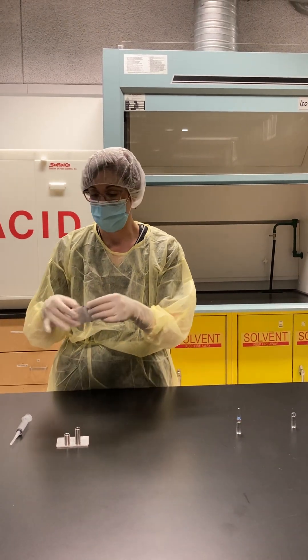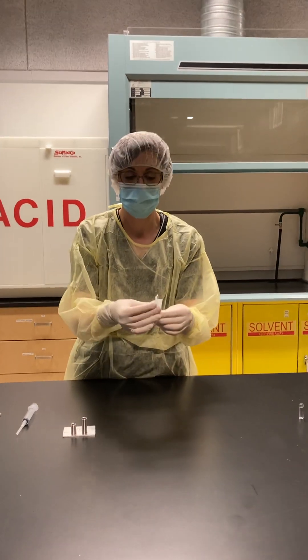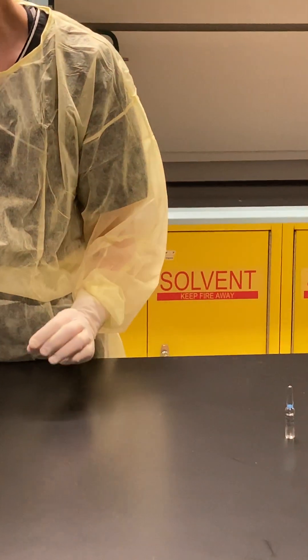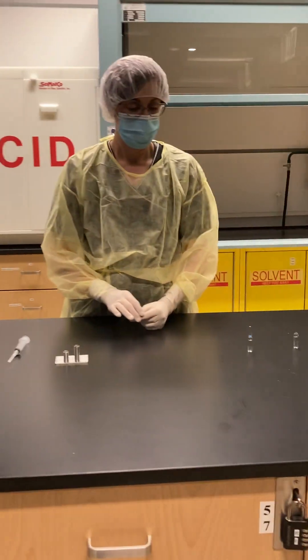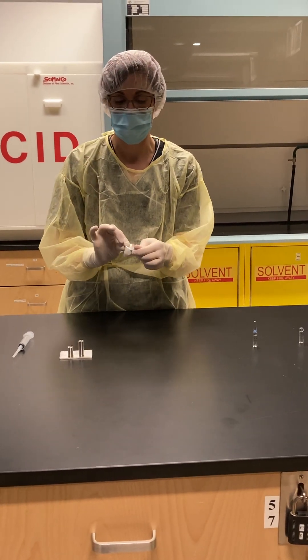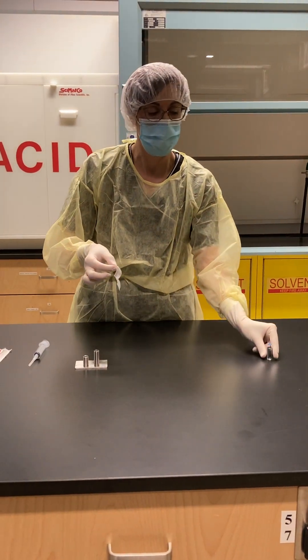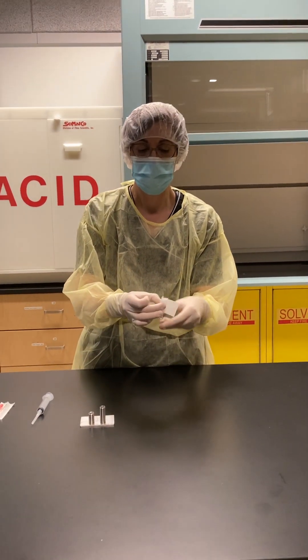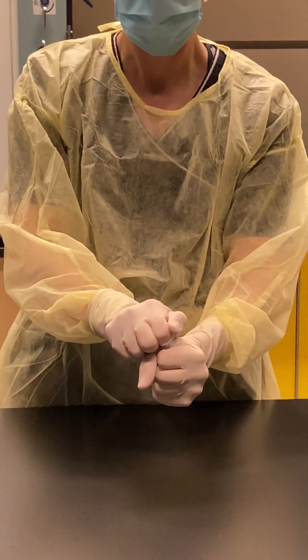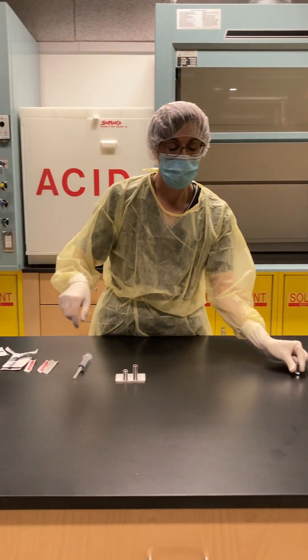Take an alcohol swab first, disinfect your ampoule and let it dry, then take another alcohol swab. Carefully open it, wrap it around the neck of your ampoule, and again snap towards the side of your hood. Always discard in the sharps container.